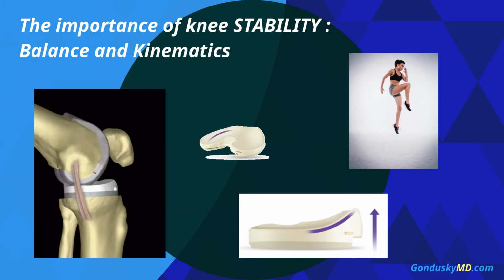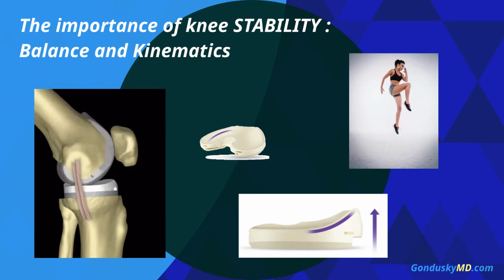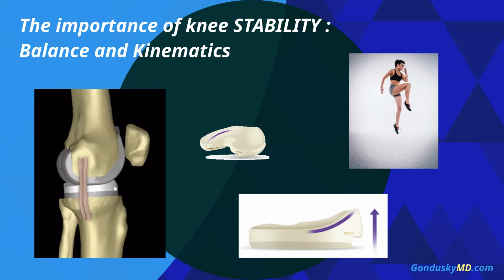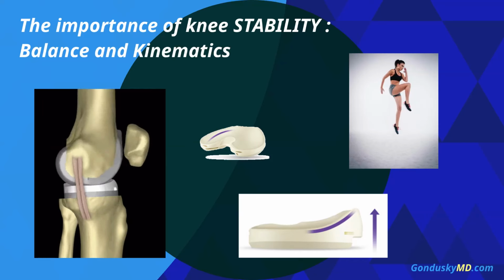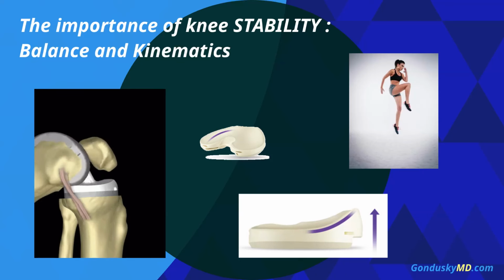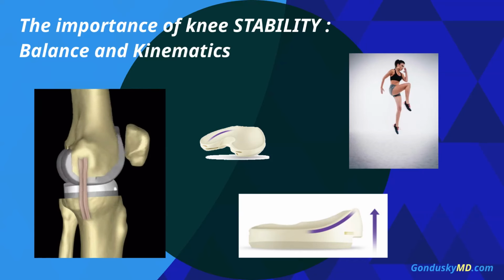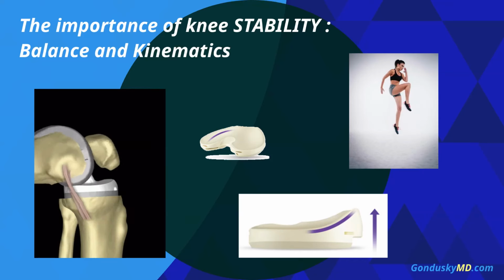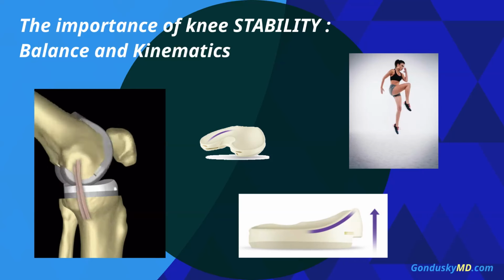So that's that picture of that plastic there. That's what's called a medial stabilized polyethylene. So it's a piece of plastic that's engineered to increase the front to back stability of the knee joint by creating a concave surface on the inside aspect. So it's kind of a bit of a technical thing, but that's something that I did with Johnson & Johnson, and we use that as an adjunct to stability along with their knee replacement components. And that was a fun project to work with international experts to really try to figure out ways to improve currently well-functioning knee systems, but to make them even better, especially in higher demand patients and patients that are really desiring more activity out of their joint replacements.